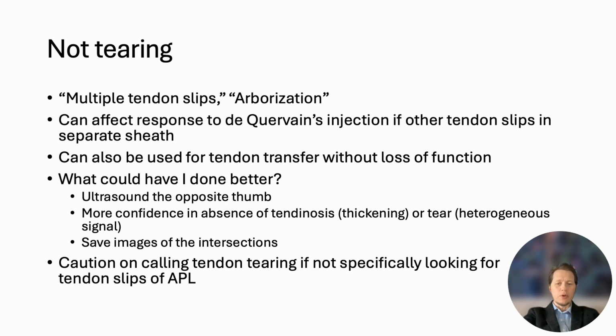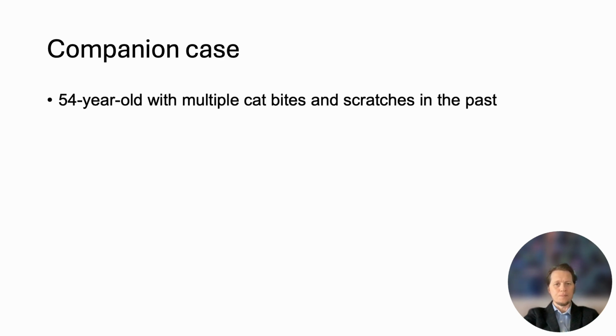So teaching point here, if you've never seen this before, watch out when you're scanning the APL and have some caution on calling a tendon tear if you're not aware of tendon slips.